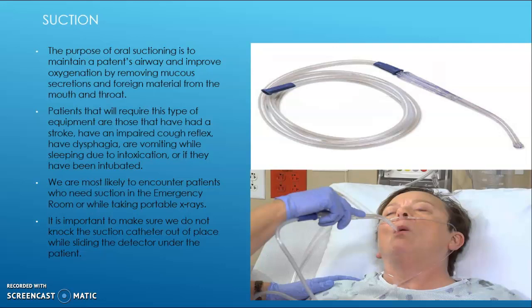We're most likely to encounter patients who need suction in the ER or while taking portables up on the inpatient floors. It is important to make sure we do not knock the suction catheter out of place while sliding the detector under the patient. We need that airway preserved.